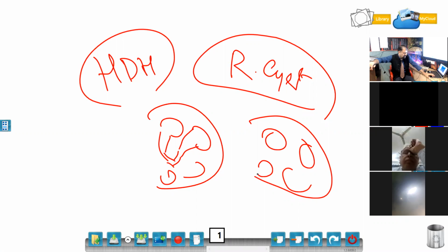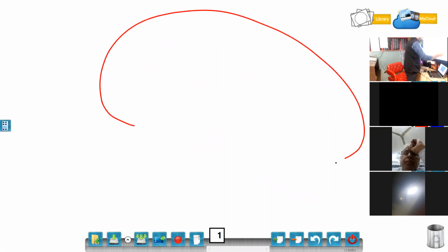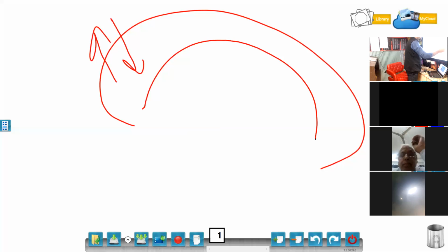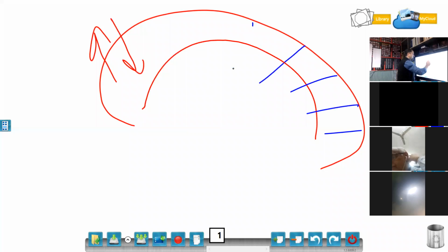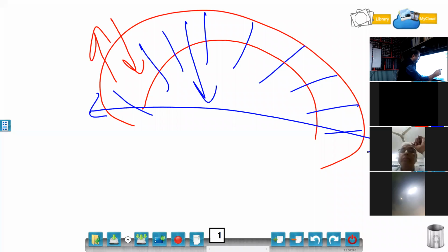So what is left now from the kidney? Pyelonephritis. Now, in pyelonephritis, how will the kidney be? First of all, the renal echogenicity. We will not expect it to increase, but it will decrease, because the rule of inflammation is that wherever there is inflammation, the echogenicity has to drop. And what will be the length or the width of the kidney? Increased, increased, and increased. And there will be tenderness, and these are the findings of pyelonephritis.